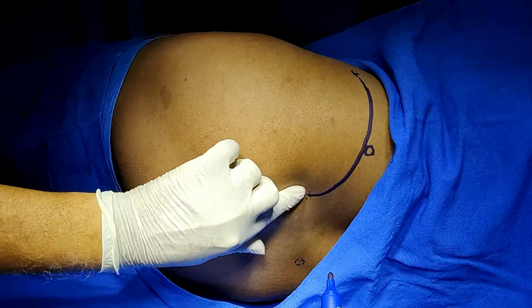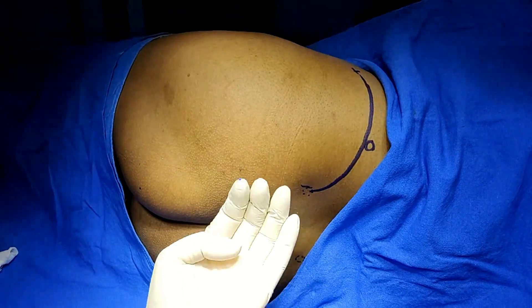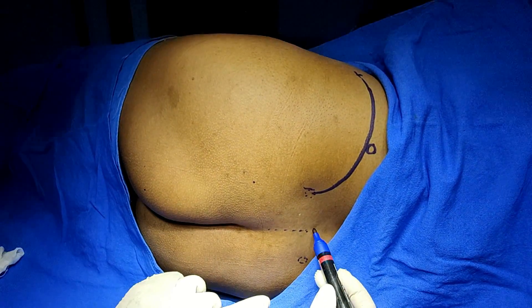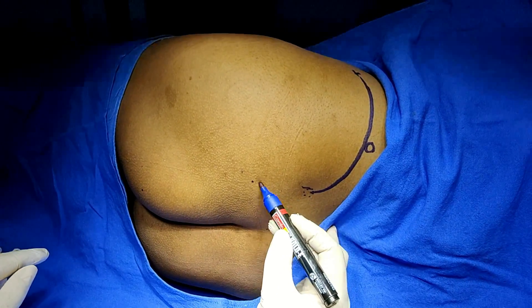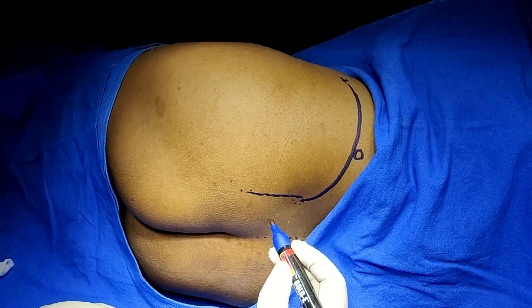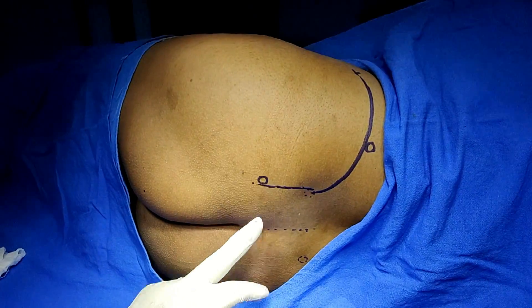From the outer margin of the posterior superior iliac spine, three finger-breadths below — draw a parallel line to the midline. Three finger-breadths from here gives us the point of entry for the sacral plexus block. This point will anesthetize the lumbar plexus, and this point will anesthetize the sacral plexus.